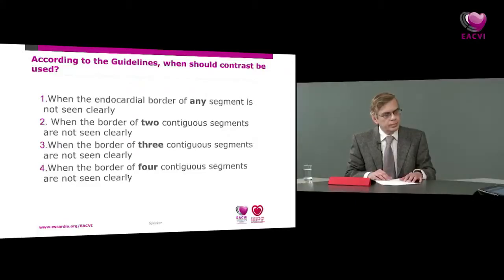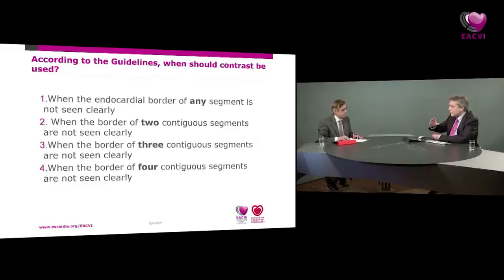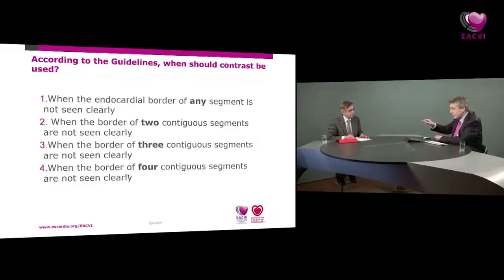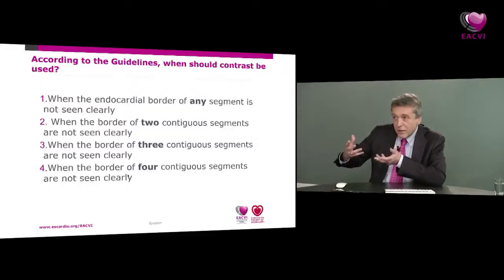So when you're doing a dobutamine stress echo with high heart rates, it makes it easier. What we tend to do is, after we've finished our wall motion analysis, we press a button, and that's all it is. The preset comes up for the low MI setting, which allows us to look at myocardial perfusion over a longer loop. So we actually use both methods.